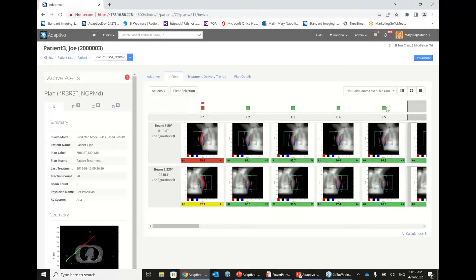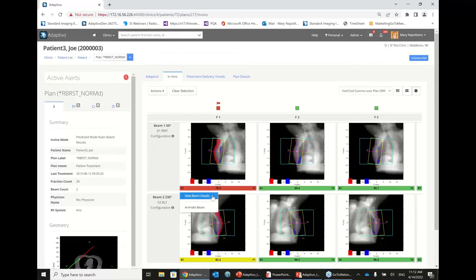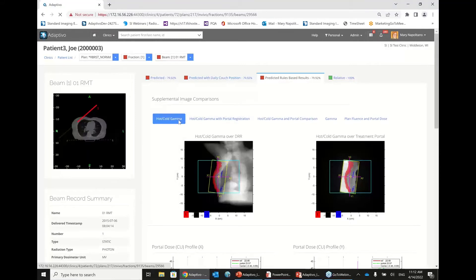Opening Joe Patient 3, we're looking at the hot/cold gammas over the plan DRR. You can see in this region there is a hot gamma failure, and some cold gamma failures here as well. Adaptivo shows both beams at this time. The gamma is calculated in the traditional manner, but with a multiplier of minus one or one depending on whether it's a hot or cold failure, which makes problem solving quite a bit easier when reviewing results.